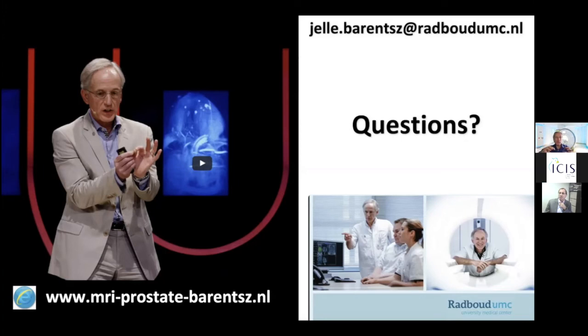For me, it is an identification. This enhances. I look at the lesion that enhances, and then I go back to the DWI and ask, is this black and white on the ADC map and on the B1400? And if yes, okay. Just like the case I've shown before, I completely missed it.